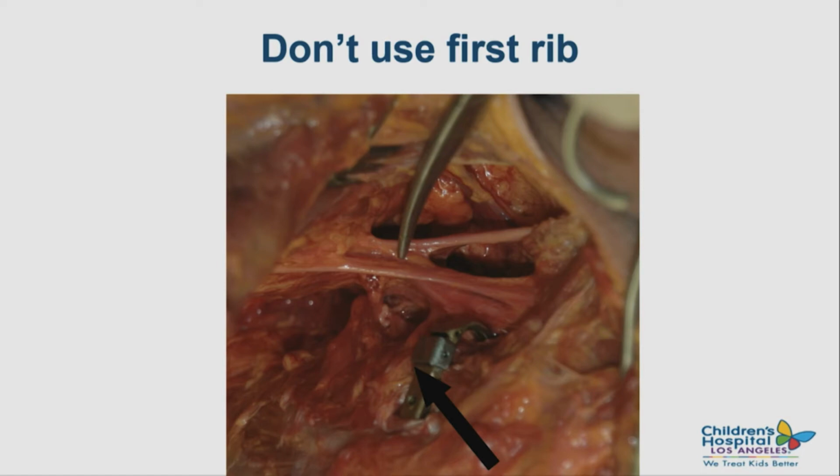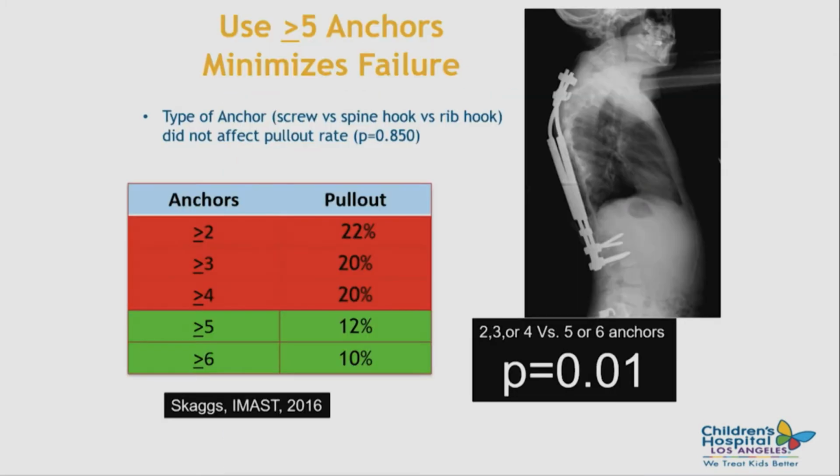Ow, it hurt again. So the lesson we learned from that is when we're pushing up on ribs, we have the arms at the side, so we're monitoring with the arms at the side. When we put that patient back to sleep, arms are up, MEPs are great. Arms are down, MEPs are not so great. So arm positioning can matter.